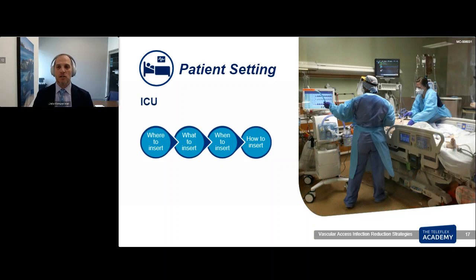So how about in the ICU? So I use all sorts of vascular access devices in the ICU. I still use peripheral IVs. I still use rapid infusing catheters. I still use IOs. But obviously I place also a lot of central venous catheters. I place triple lumens. I place MAC catheters. I place acute hemodialysis catheters. Those are all incredibly important for the patients.